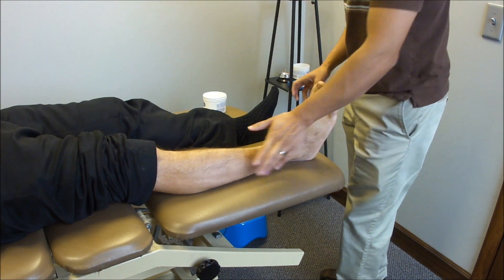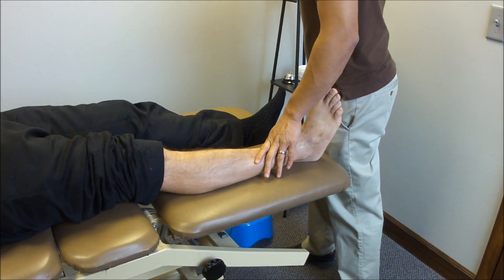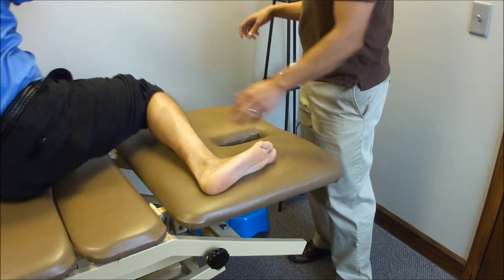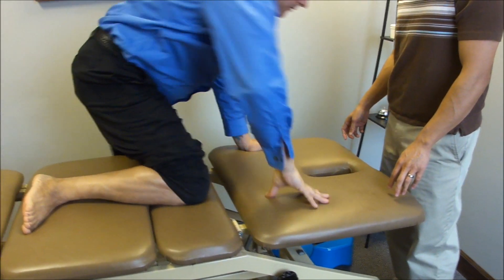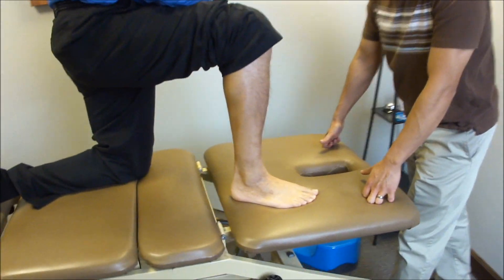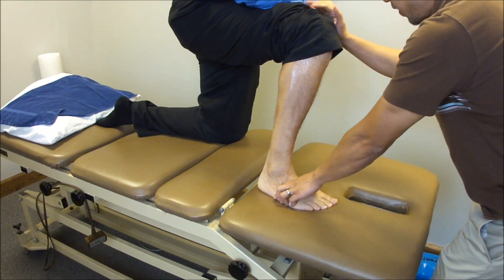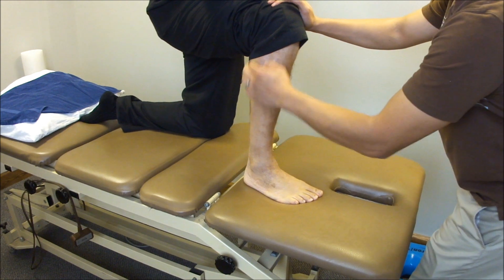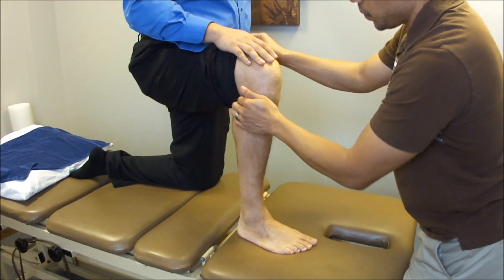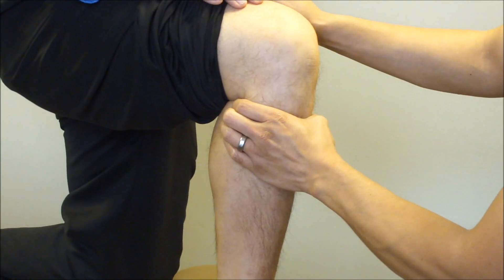I wouldn't normally have a patient up on the table, but just for filming purposes let's get him in a half-kneel on the table. You can already tell his dorsiflexion is limited because he everted so much, so let's put him in a better position. My mobilizing hand is going to be posterior to the fibular head — I'll grasp about two fingers' width.